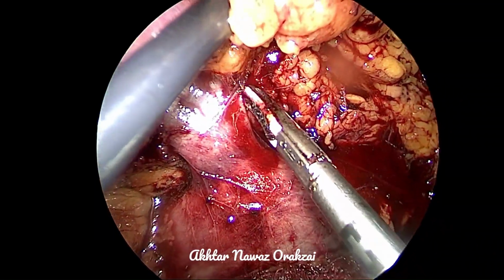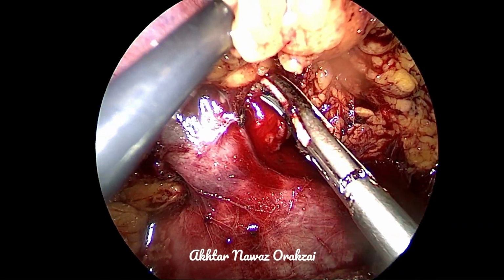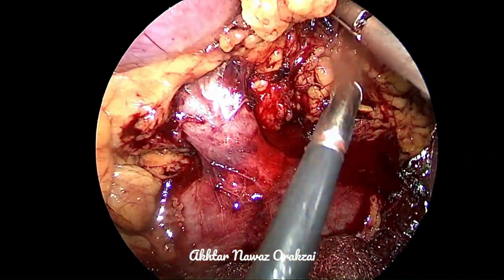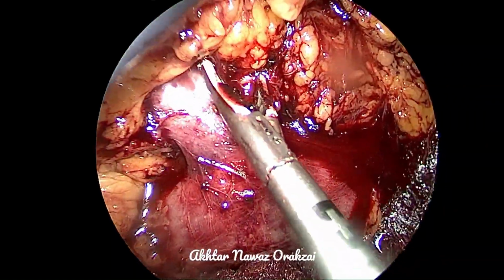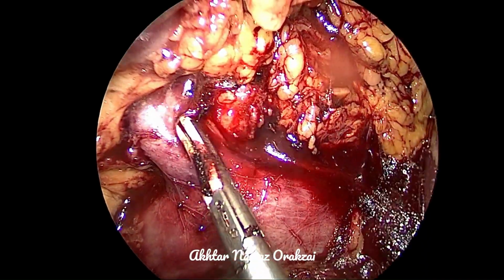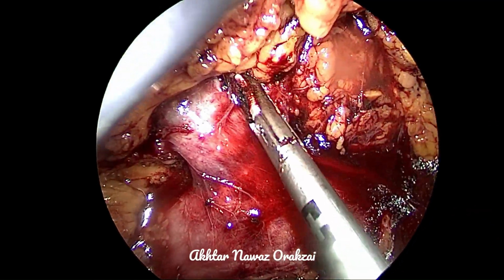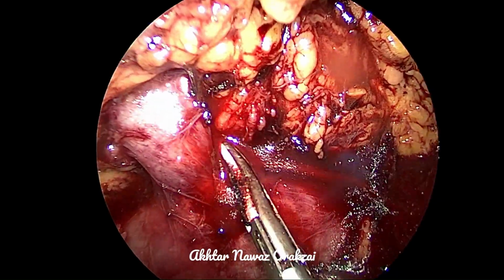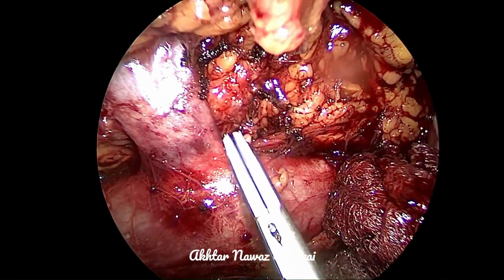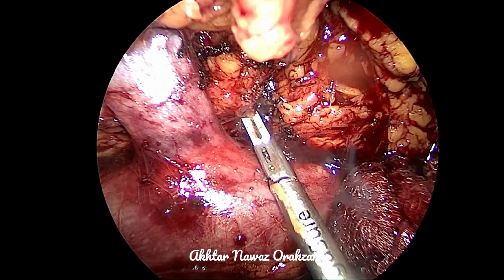As I mentioned earlier, this small venule seems to be small, but when it starts bleeding, it becomes horrible. So in order to control this vein, we need to take control of the artery, and to take control of the artery, we need to dissect it properly and away from the vein, so that when we are applying a clip to the artery, we must not catch the wall of the vein, or perforate or injure it.